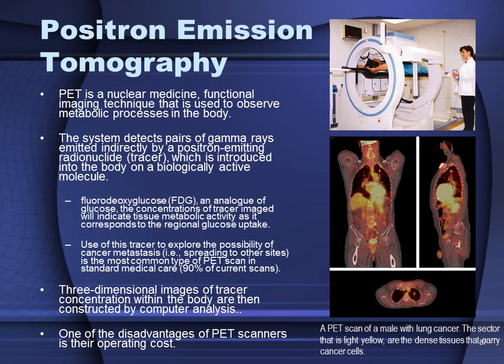The one big disadvantage of the PET scanners is their cost for operation. The cost is so high that often one scanner is shared between many hospitals, such that a mobile scanner is used, or a scanner placed on a truck that travels between sites when a patient is in need.